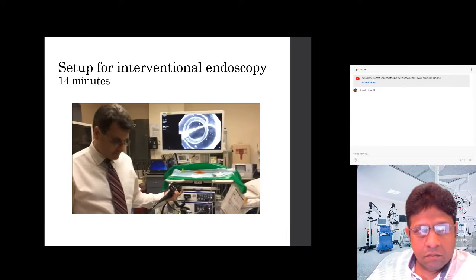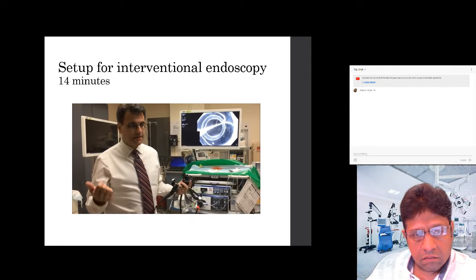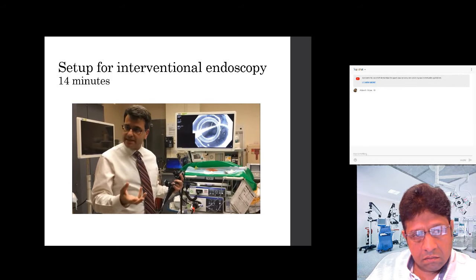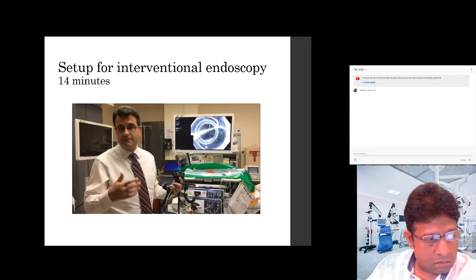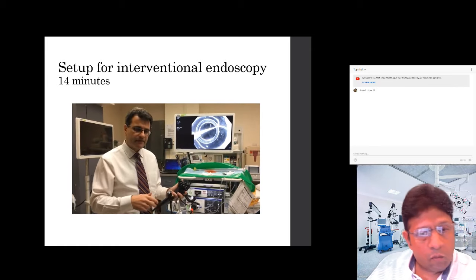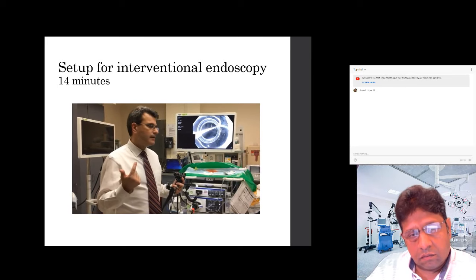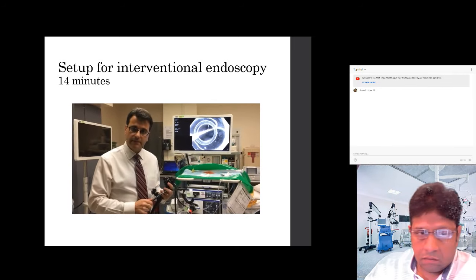So that's really the last of the tools. So just to summarize then, 2 emergencies really, very simple. Foreign body, right? We talked about the overtube. We talked about the grabbers, basket, snare. These are all the devices that we can pass in and out through the overtube to pull out whatever we're trying to get. That's the foreign body. And then for bleeders, we have, particularly for variceal bleeders, the 6-shooter. And then for ulcers and other bleeding things, we've got the sclero needle to inject, bicap, cautery, and the clip. And I think that's it, right? I think we got it all. Yeah. So, great, and that's everything.